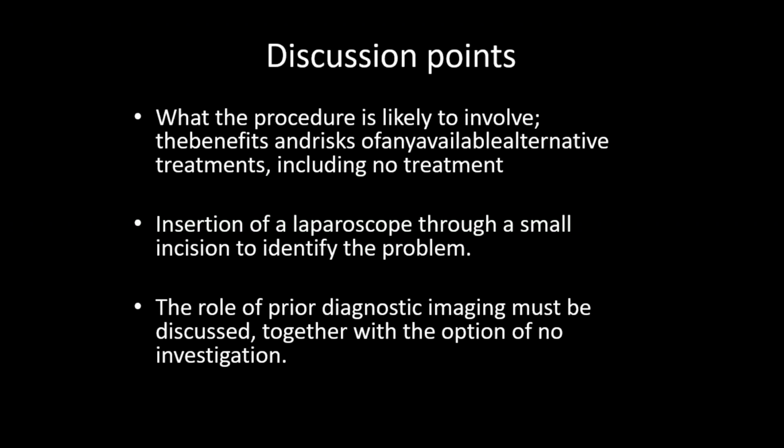The next step is you should only ensure hemostasis, otherwise stop the procedure. Don't go through the procedure any further until help is with you, because you may extend the lesion. In that sake, don't play with the instruments inside.